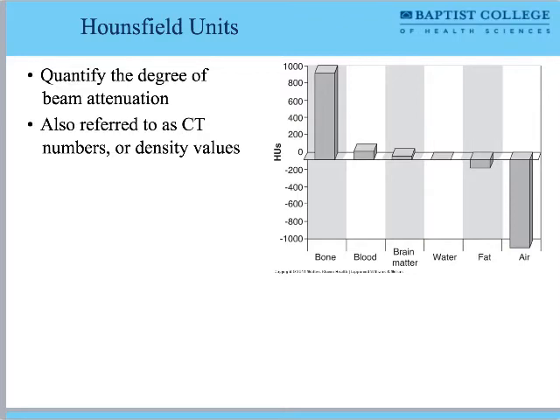In the world of CT, yes, question? On the last slide, did that say that the lungs show up in white? Because you confused me when you said that. I said it wrong. Thank you for catching that. So the lungs are going to show up black because they are low attenuation. The bone would be high attenuation, whereas nothing being there is low to no attenuation. Correct. I'm so glad you caught that. So the lungs are low attenuation. They will show up black on the image. The bones are high attenuation. They attenuate a lot of stuff, so they will show up white on the image.